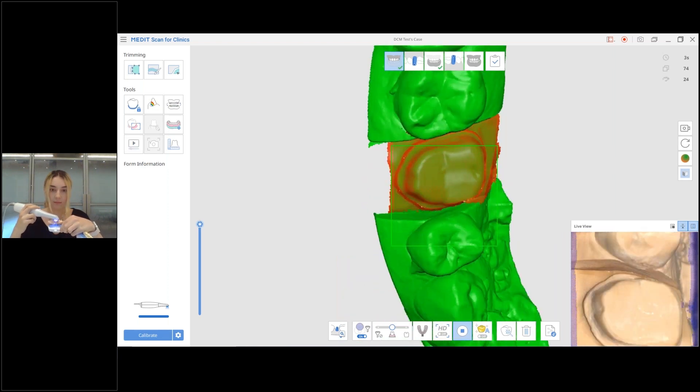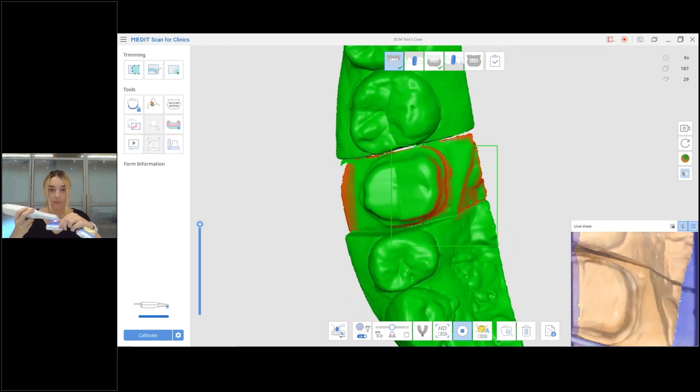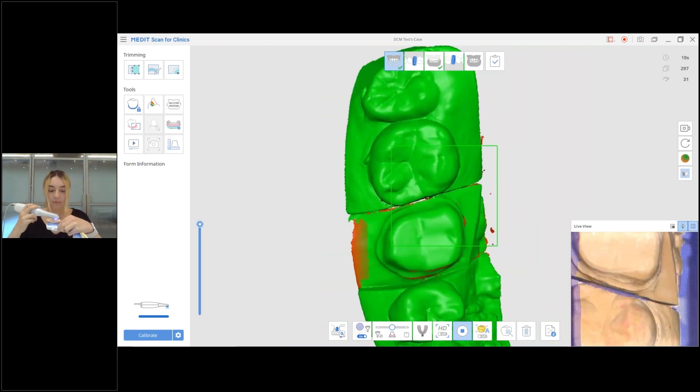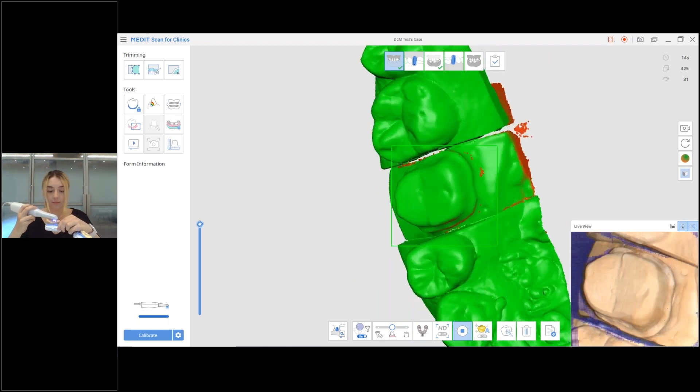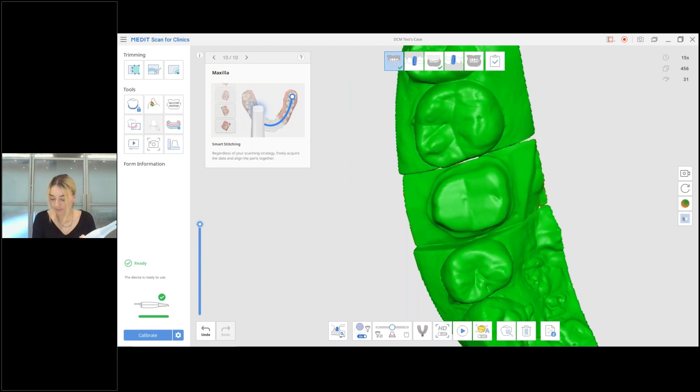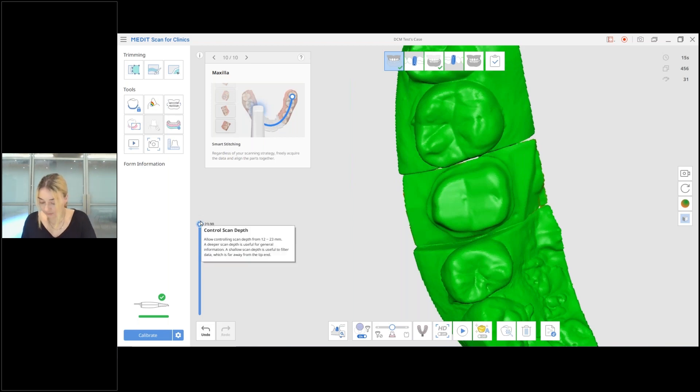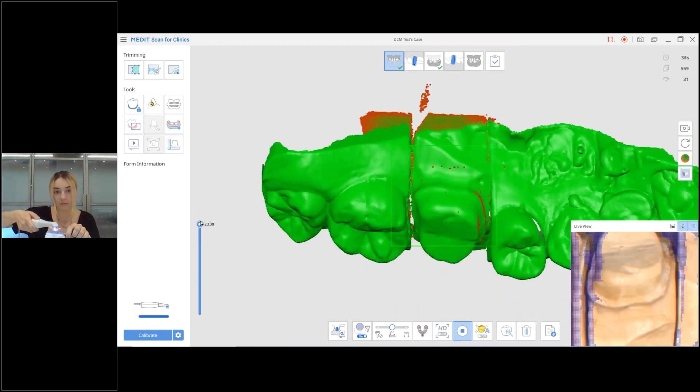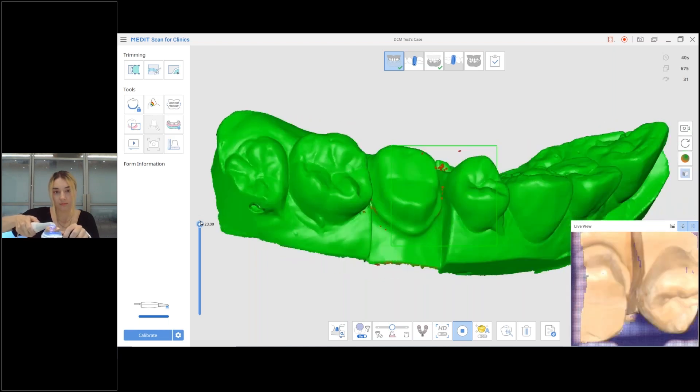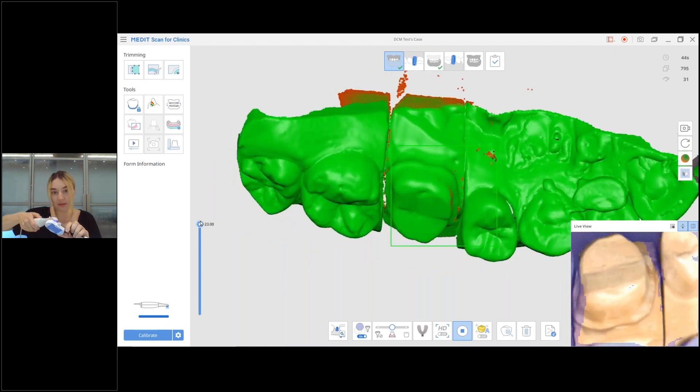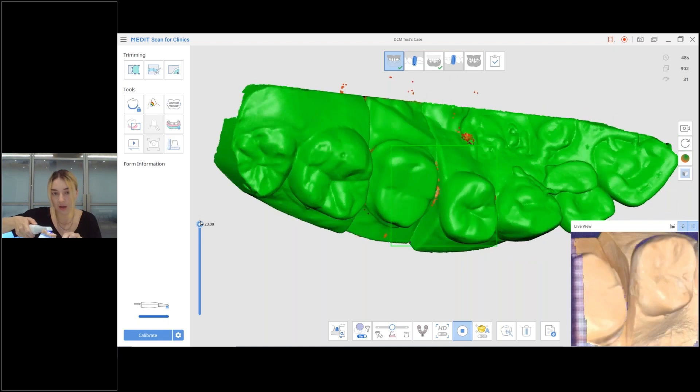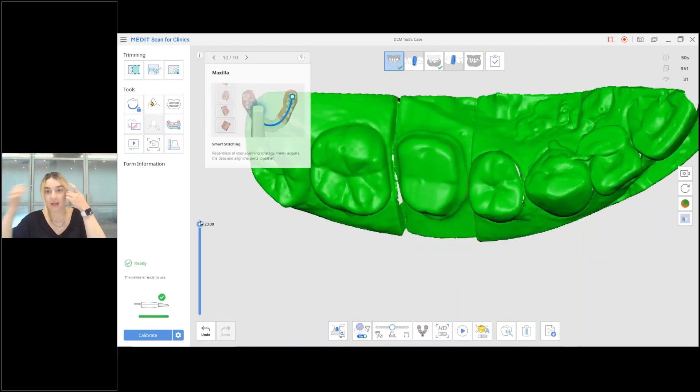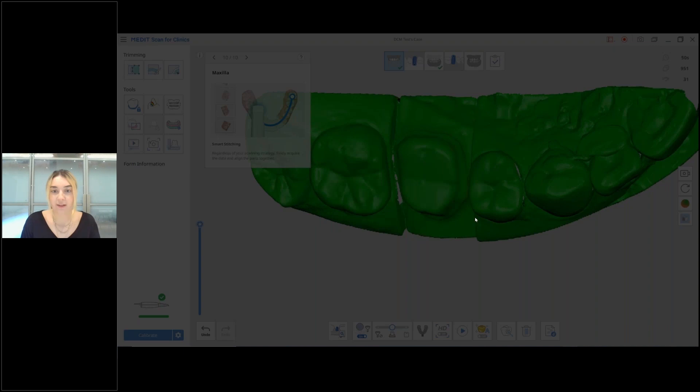What I could do is I could import my DCM files, convert them, open it just like this, and then I can trim out this part. We imagine right now that it's a diagnostic scan and no prep tooth was there, and I trimmed out this data and I'm going to use my scanner to scan this part again. As always when you're adding new information to a model you want to make sure that you start on a previously scanned area when you cut something out, and then you can move over the cutout area and add the information there. Another thing we were talking about yesterday - it does help to increase the scan depth a little bit when scanning a prep. What that is - the Medit uses two cameras, so it's almost just increasing the scan depth as you're scanning. It's a helpful tool to use while you're doing preps and so forth, scan bodies.